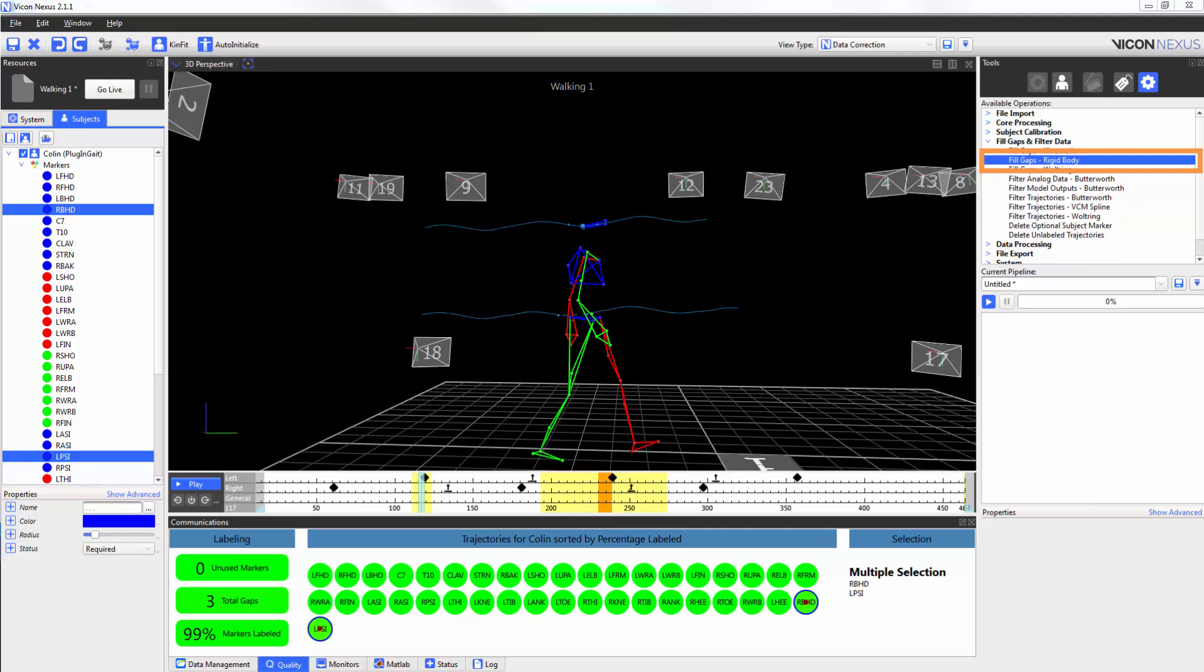The fill gaps rigid body pipeline operation can be used on rigid body marker clusters containing four or more markers. If a marker trajectory drops off, the fill gaps rigid body operation uses the trajectory of the remaining markers to interpolate the missing trajectory. You need rigid body clusters of at least four markers because with the three remaining markers, we can still recreate a plane.